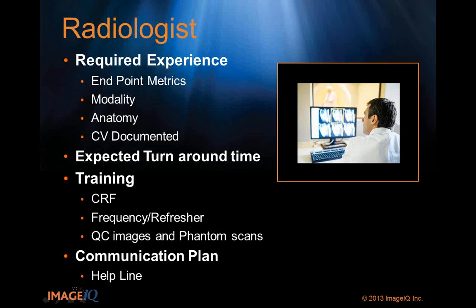And then we suggest testing, though that's a little overstated. Certainly you don't want to tell your radiologist that you're going to test them. That may freak them out a little too much. But scan a phantom or healthy patients with some known values, and have them complete the CRF to make sure that what you told them was digested, they took up the information correctly, and they're able to reproduce predictable results. You know the measurements, so is the way they measure it the same?